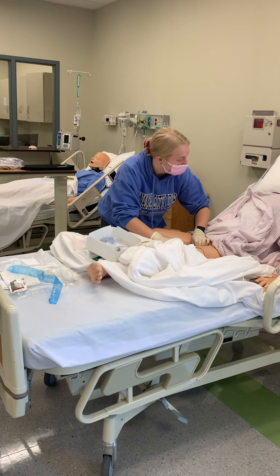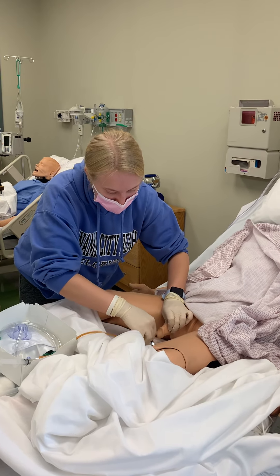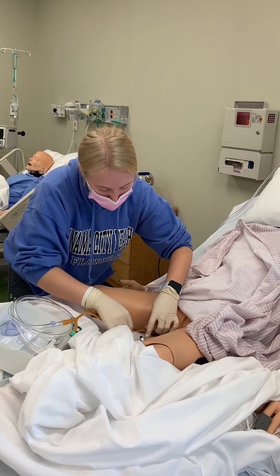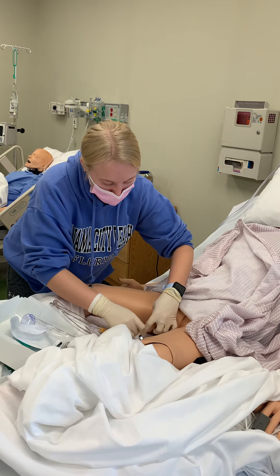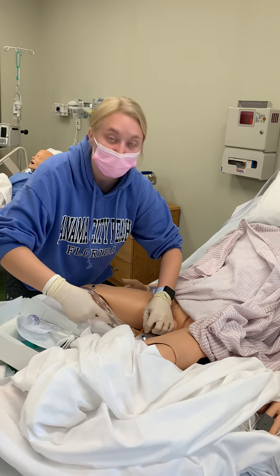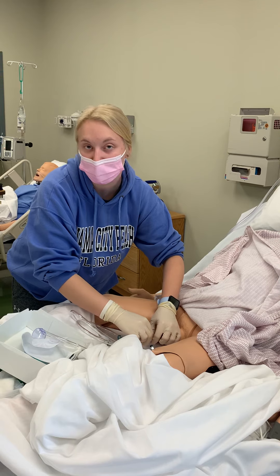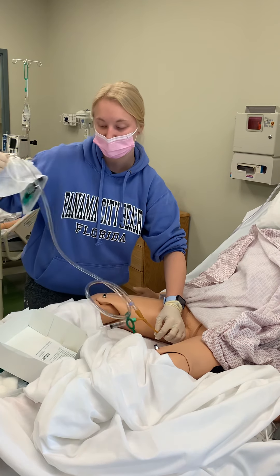I'm going to go ahead and just feel a little bit of pressure. Okay. Now this part I would go ahead and blow the balloon up, but since it's a mannequin I'm not going to do that. And then I would, after I put the water through, I would pull back and see if there's resistance, and if there's resistance I'm in the right spot. And then I would go ahead and hook this up, or remove the syringe and hook this up.